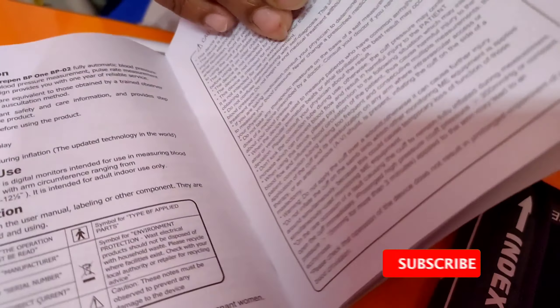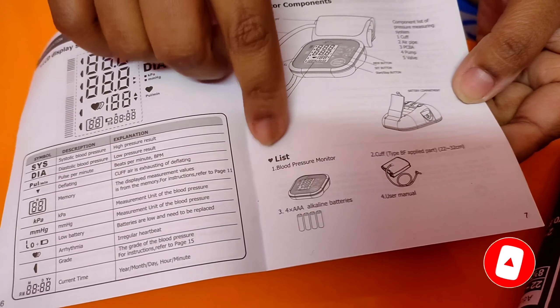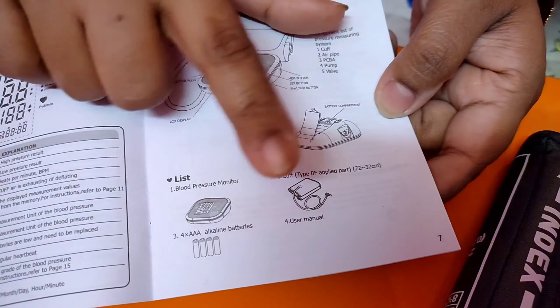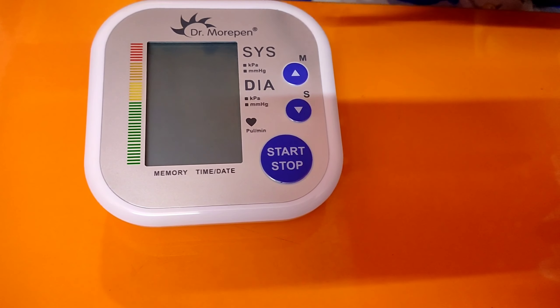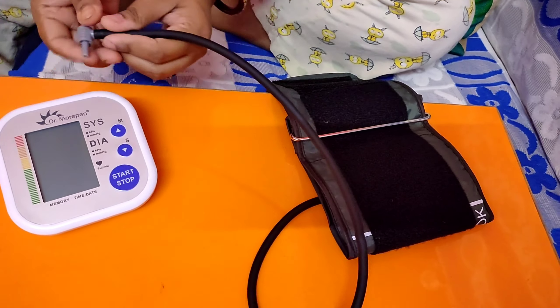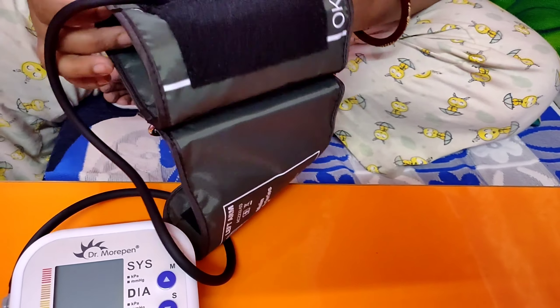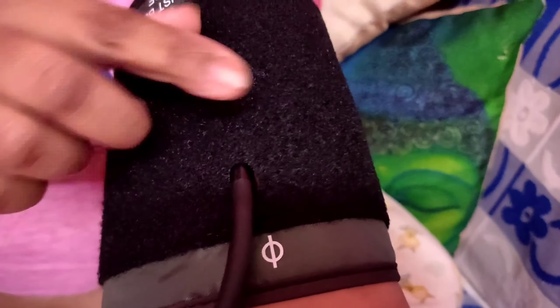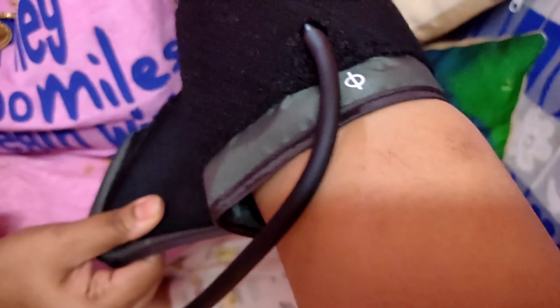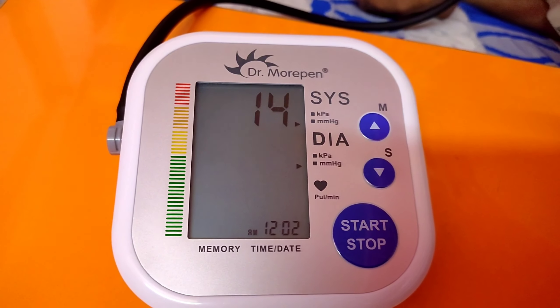Now I am going to give you a demo of how easy it is to use and monitor your blood pressure at home. First, insert the cuff into the BP monitor machine with the help of a connector that has been provided, and then put the cuff on your left hand. A detailed picture guideline has been given on the cuff to help the user how to put it on the arm.